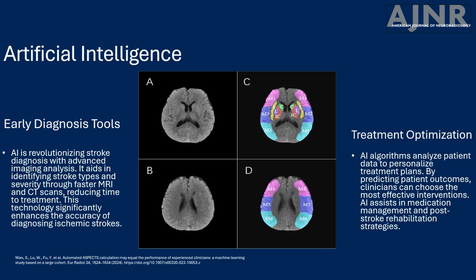Nowadays, you can't really talk about anything in medicine without touching on artificial intelligence, and AI, as in every field, is rising as a leading component. In this case, for stroke imaging, it's expected to further change acute and non-acute stroke care. There are three main use cases where AI offers potential benefits.